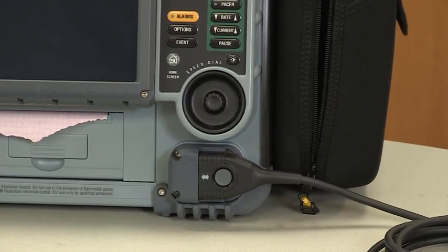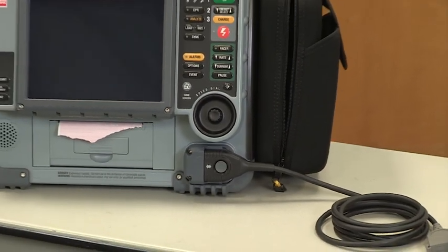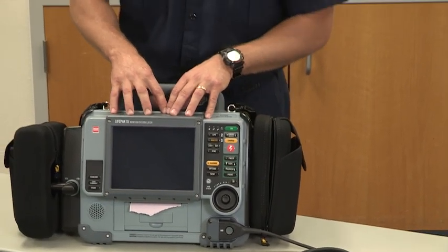If we need to clean the unit itself, we can simply use a mild detergent, soap and water, a 409-based product, or something such as that if you have grease, dirt, grime on the unit itself. Or again, you can refer to one of the hand wipes that have the isopropyl alcohol or the peroxide base in it. As a review, just do not use a bleach-based product for cleaning the LIFEPAK 15.